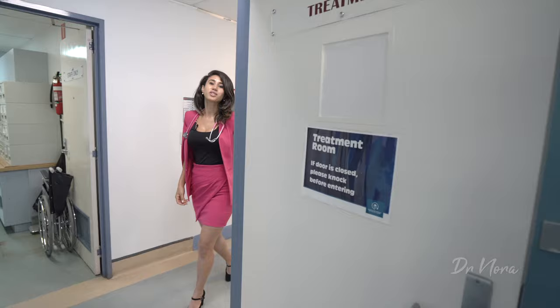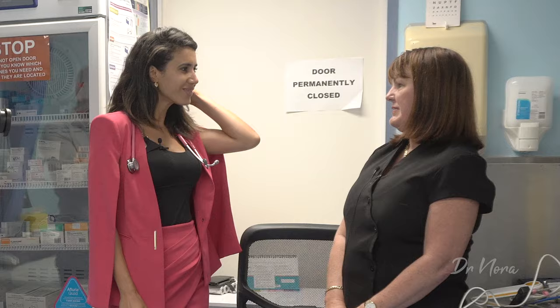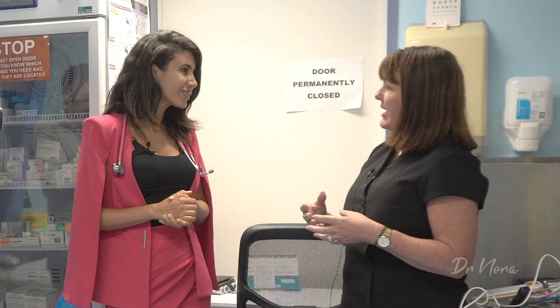Taking us through the spirometry procedure is our beautiful practice nurse, Tracy. Tracy, thanks so much for joining us today. You're very welcome. So Tracy, what is spirometry? Spirometry is a lung function test to see if you've got any underlying conditions like COPD and other kind of respiratory illnesses.